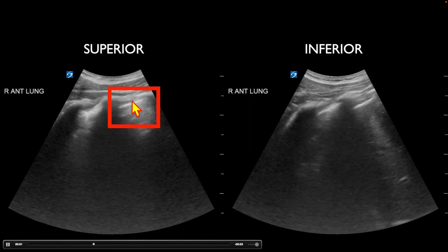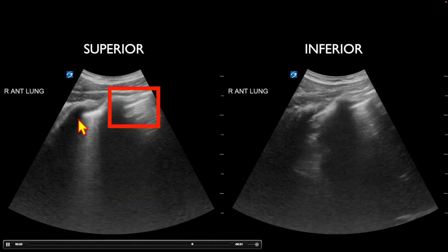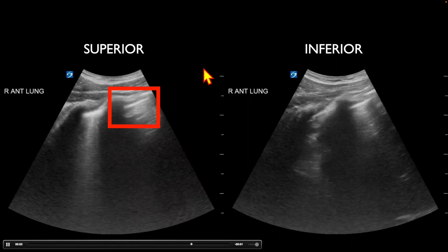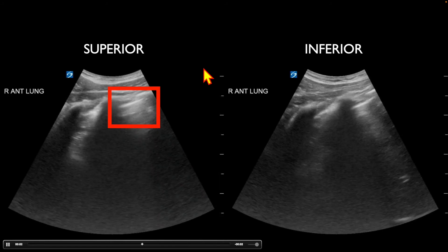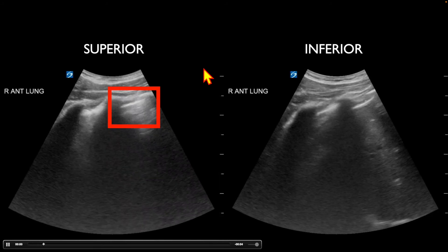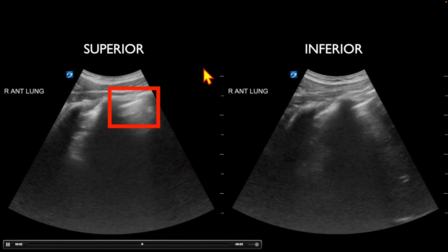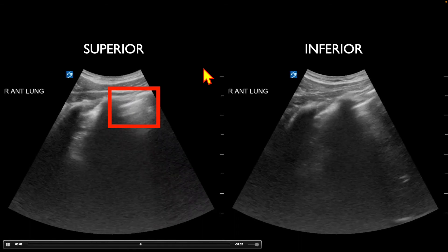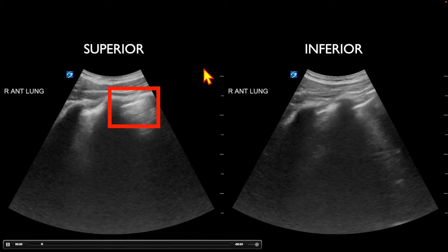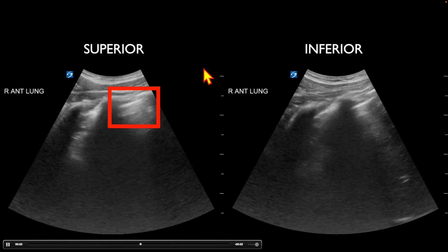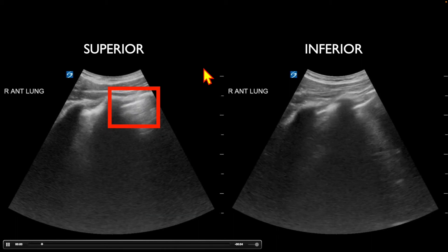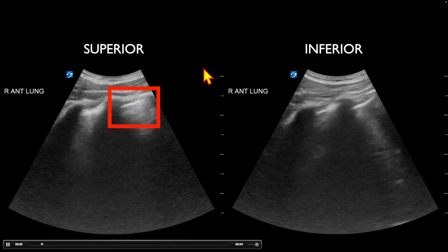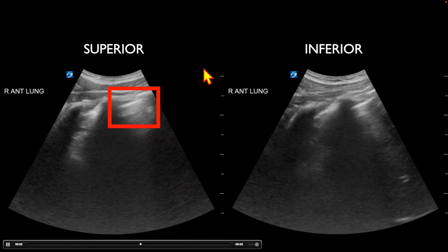Also notice how bright and hyperechoic this area is. If we backed off on the gain, we would probably have a little bit better view of the pleural line and be able to appreciate that sliding a little more. So keep in mind that depth and over-gaining of the image can make it difficult to interpret. One other thing you could do is switch to the linear probe if you wanted to further evaluate that, as this is often a high-frequency probe that allows us to see the pleural line just a little bit better.